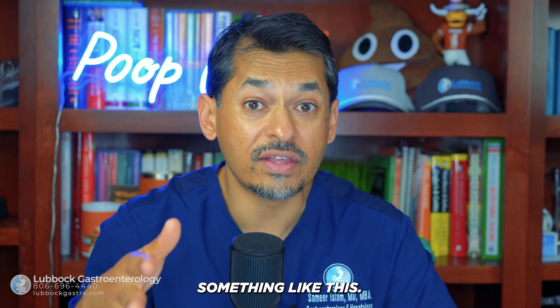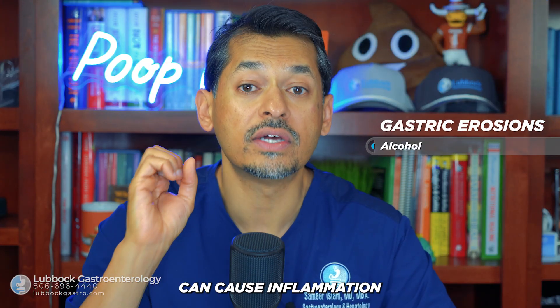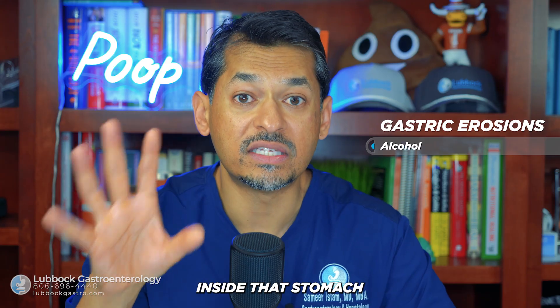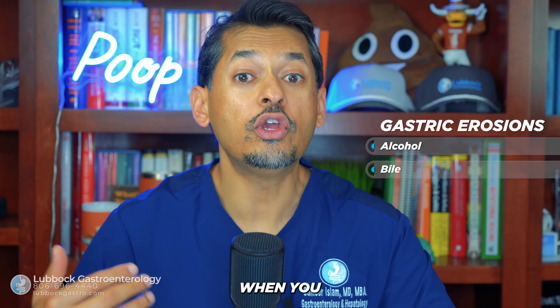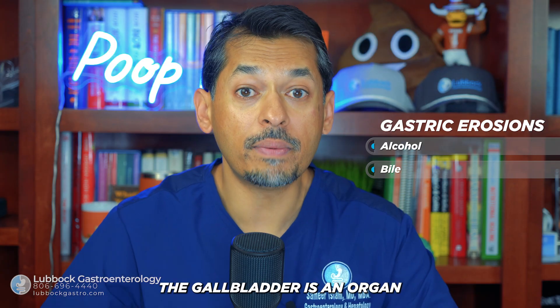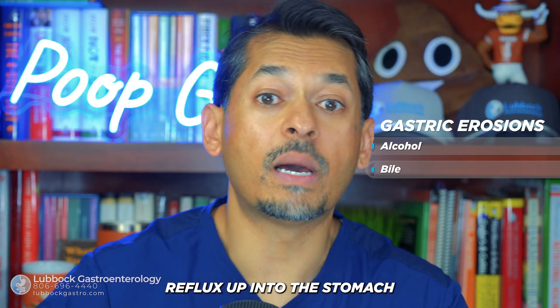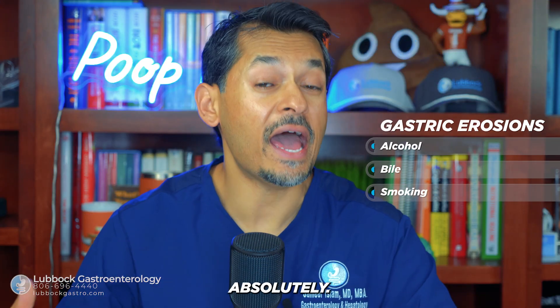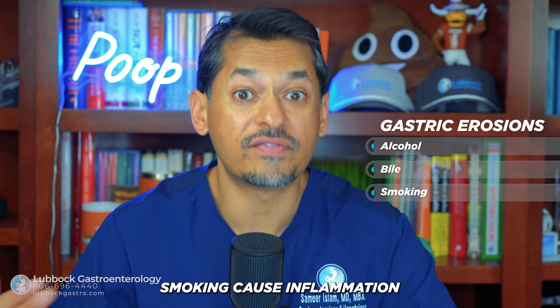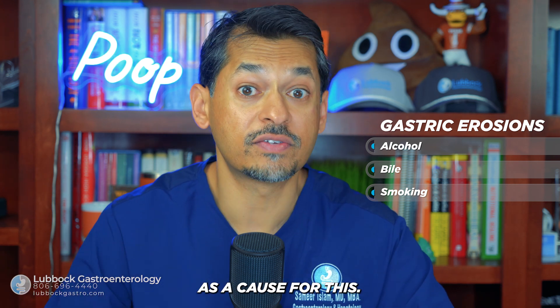When we see something like this, there are a couple of things I think about that can cause these erosions. Number one, alcohol. We know that alcohol can cause inflammation inside that stomach — it's called reactive gastritis. Number two is bile. When you've removed your gallbladder, the gallbladder is an organ that stores bile. When you remove that organ, bile just refluxes up into the stomach to cause bile acid reflux. Number three, smoking. Smoking can cause inflammation and erosions to occur, and a lot of people underestimate smoking as a cause for this.